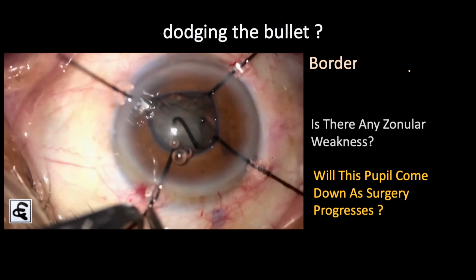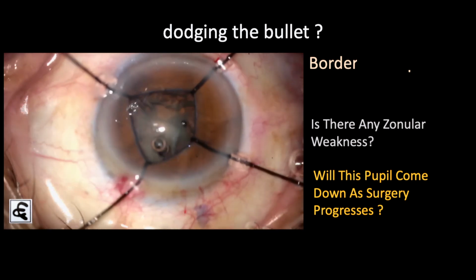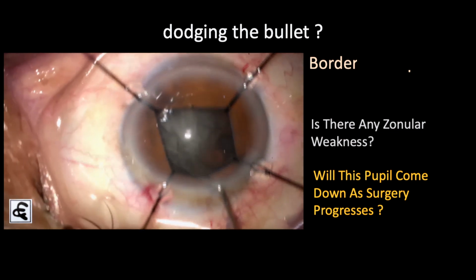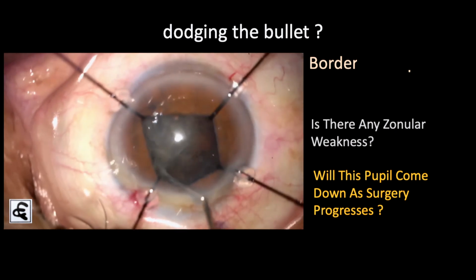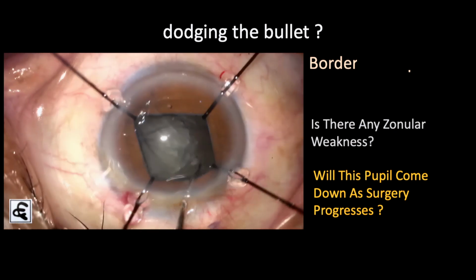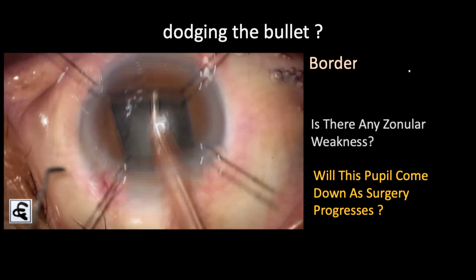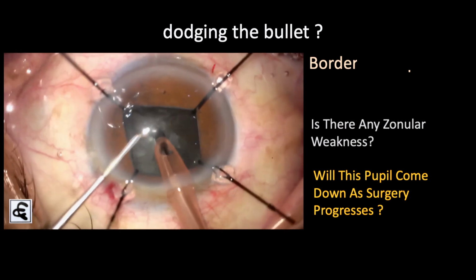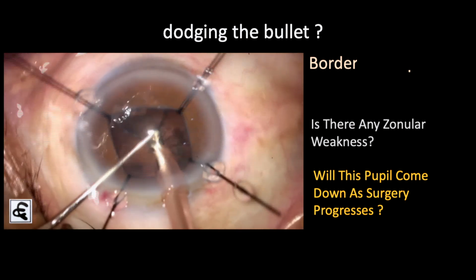And once you have all the 4 capsular hooks in, then you know that you have literally put an external zonules and external support. But it would still be important to remember that there will be no equatorial support. These are just supporting on the sides. Now, this rotation is very critical because you know that you have to do a safe phacoemulsification, and for that you need to have a rotating nucleus. And you go in, bring down your bottle height, bring down your parameters, go slowly. This video is played at a slightly faster speed than it was actually done.